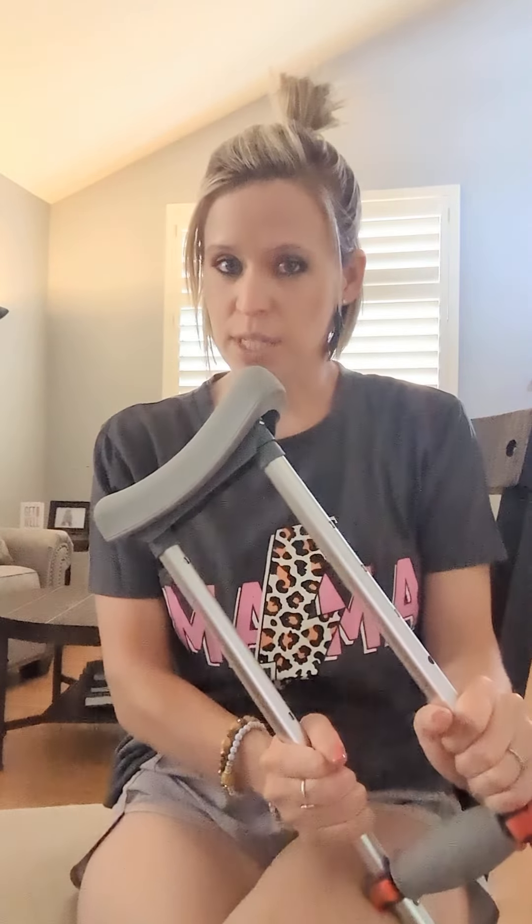Hello, Heather Gibson here, Doctor of Physical Therapy. I wanted to do a quick video today and go over some information about how to use your crutch as your assistive device. So if you've recently had a surgery and you're not able to fully weight bear on your extremity yet, and you're getting sick of using the scooter or putting all that pressure on your knee, then crutches are always an option.